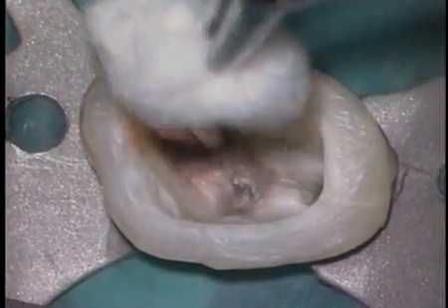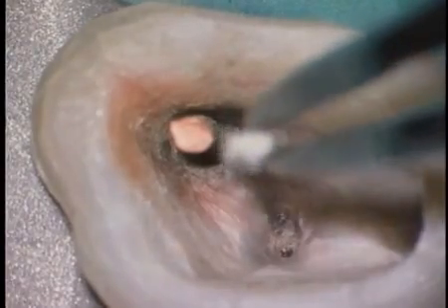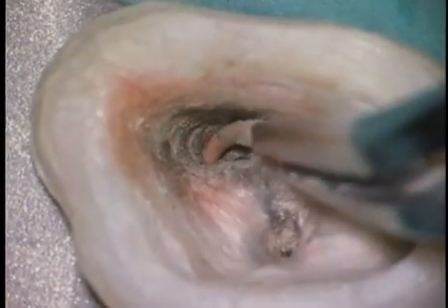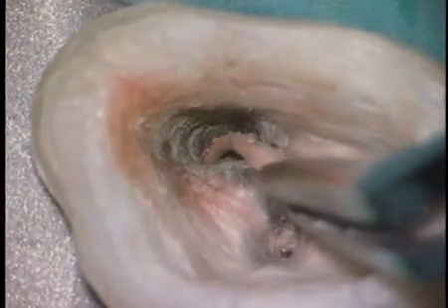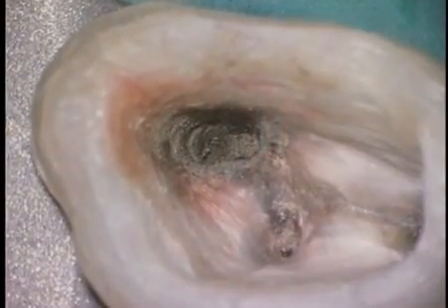The Cavit can be removed, the cotton pellet removed, and the paper point as well. When we grasp the gutta-percha point, pull very gently so you don't break it. Notice its curvature as it comes out. The canal is now ready to clean, shape, and pack.